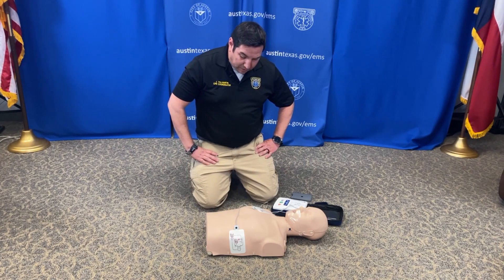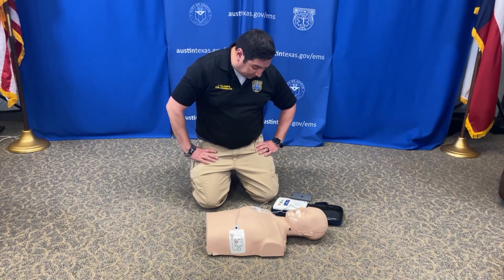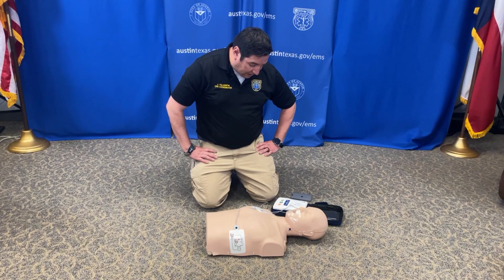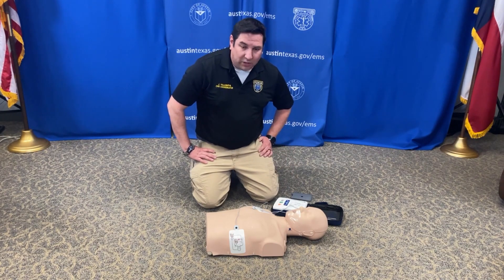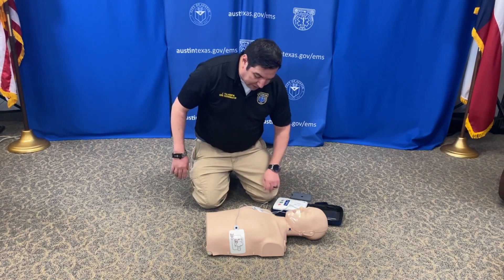Do not touch the patient. Analyzing heart rhythm — don't touch. Everyone stand clear. Shock advised. Do not touch the patient. Stand clear. Press the flashing shock button. Now our AED is ready to shock. One last time — you're clear, I'm clear, we're all clear. Hit the shock button.